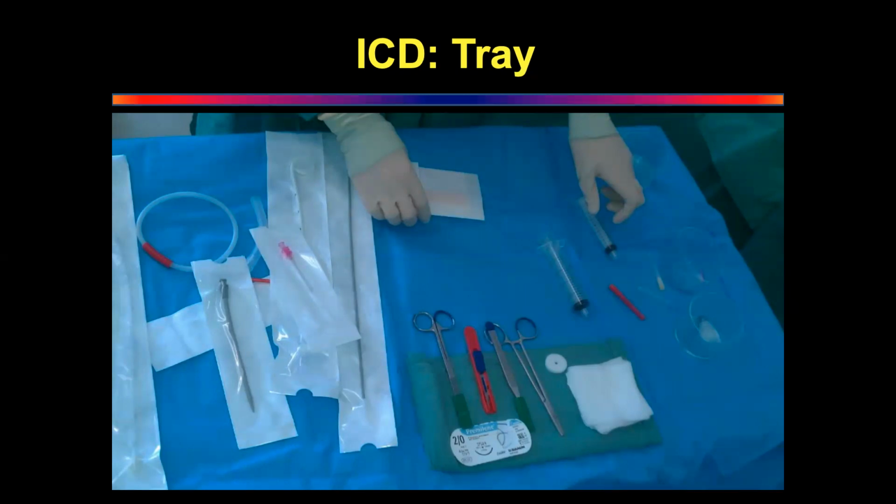You should be... the curve of the pigtail should actually go in. The whole of the pigtail should go inside. No, never more than 1 centimeter. That is the answer. Okay, never more than 1 centimeter. Okay, sir. The intrapleural depth should never be more than 1 centimeter. Otherwise, you will enter the lung inadvertently. Okay. Next.